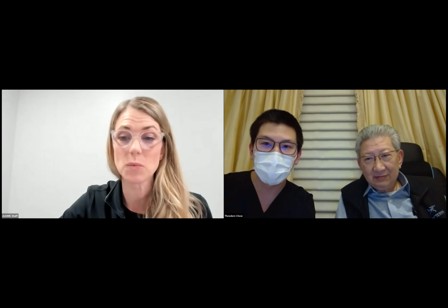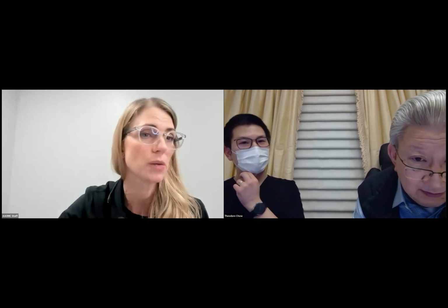We do have a few minutes for questions, and I know we have some questions rolling in. So let's jump right into that. The first question is asking about sagittal depth difference. When would you start considering a toric design? I know you mentioned, Dr. Chow, that a lot of people will say 30 microns. Do you agree with that? Do you do something a little bit different?